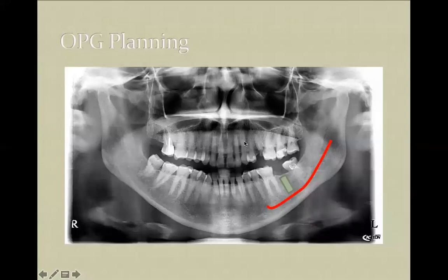But sometimes, after a tooth extraction done a very long time ago, you might have the level of the sinus somewhere here, and there's not enough space, and you don't want to place short implants, especially in the posterior maxilla, because here we have extreme loading up to 800 newtons. So what you do is elevate the bottom of the sinus, the mucosa.